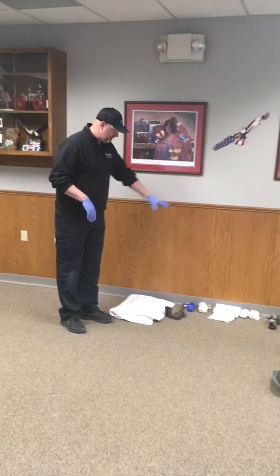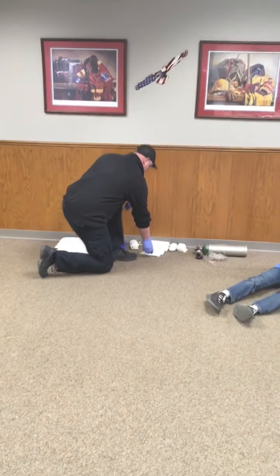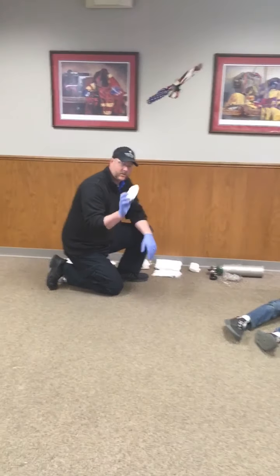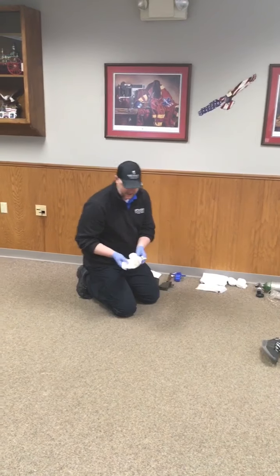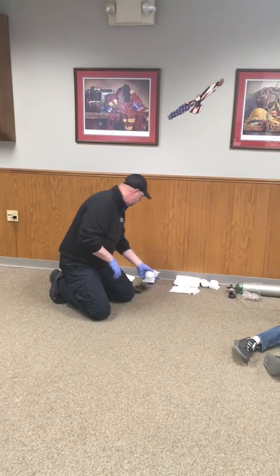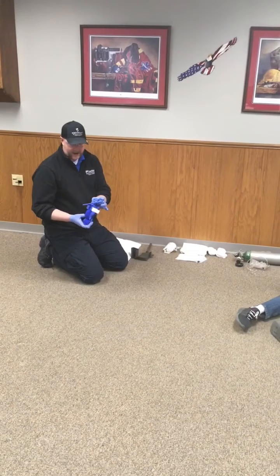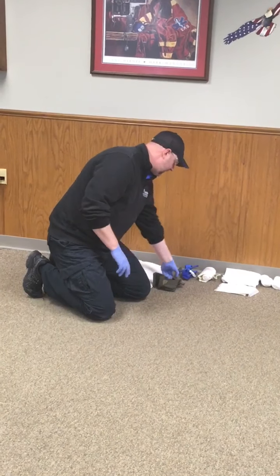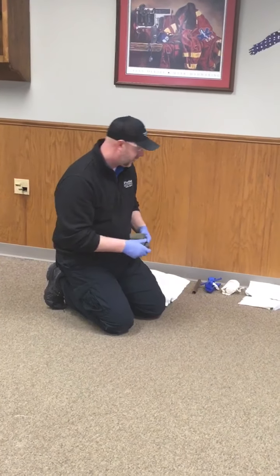You're going to have all the equipment you see here — different sized dressings from 5x9s to 8x10s, as well as Curlex or rolled gauze to secure them. There will also be an Israeli trauma bandage, or emergency trauma bandage, that has your bandage and dressing all in one. For tourniquets, we have a CAT combat application tourniquet, as well as a bar and triangular bandages if you want to do an improvised tourniquet.